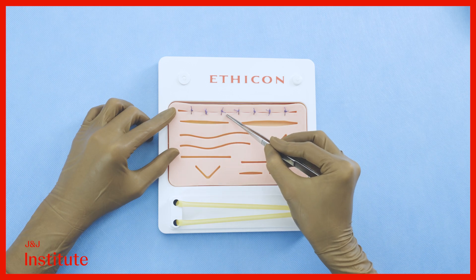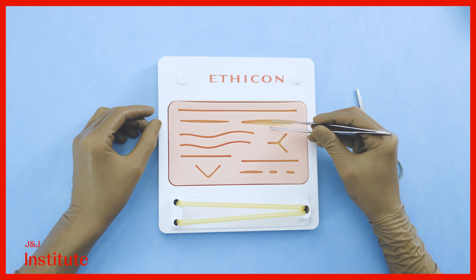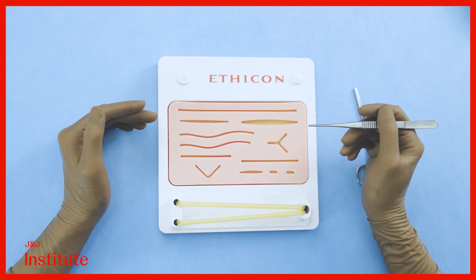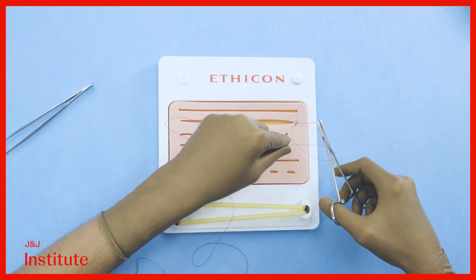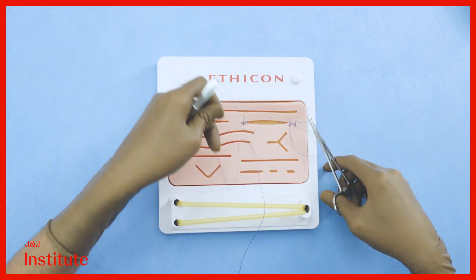To close a long linear wound, it is often beneficial to start at the midpoint and progressively bisect the incision with sutures, as seen here. For the elliptical incision, starting in the middle would produce a suture under significant tension which may not even be accurate. Therefore, we will start at one end of the incision, then move to the opposite end, and keep alternating until arriving at the center.